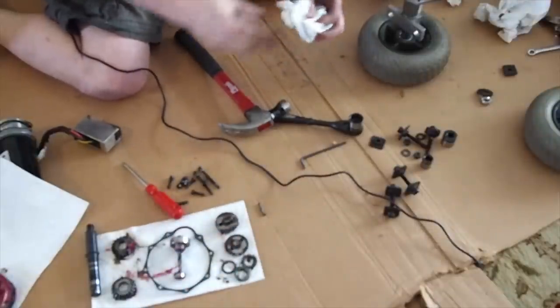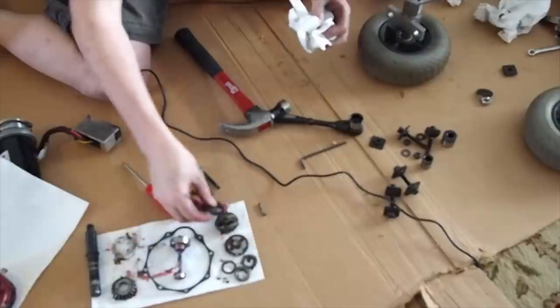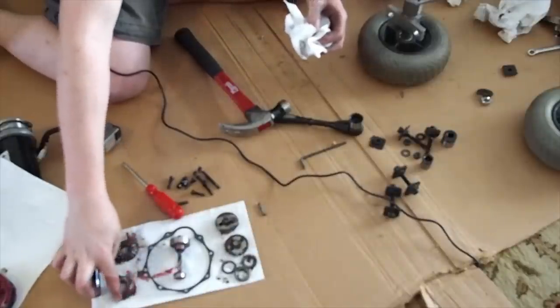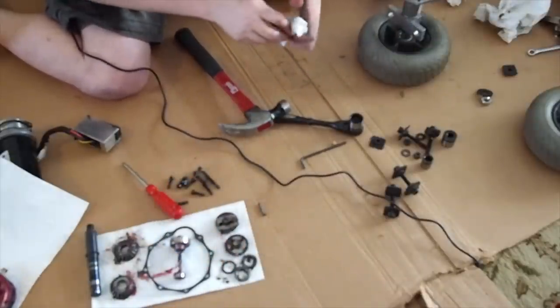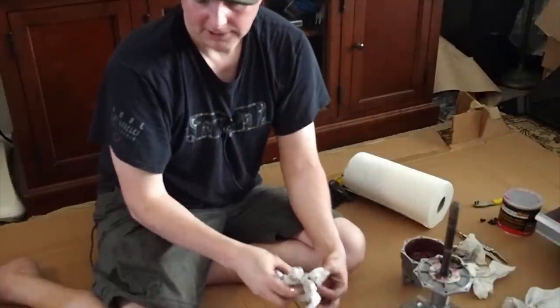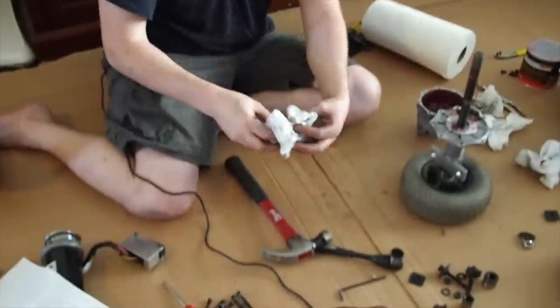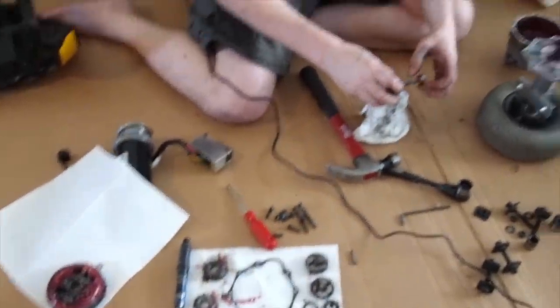I think these gears here, as far as I can tell, are all the same. Because they interlock together, they have to be the same. But these washers are not the same. So I believe that I put the washers in the wrong place. I don't know where there's information about this transaxle, so I'm kind of just doing it by the fact that there aren't a lot of parts in it. There's only four of these small gears and this big gear. One of the things I can do is let's look to see if we can see where the grinding is coming from.